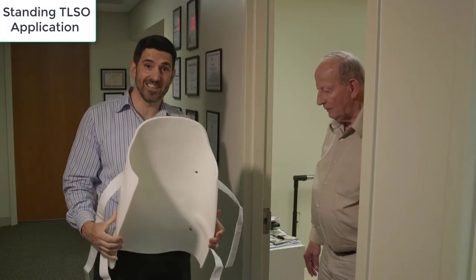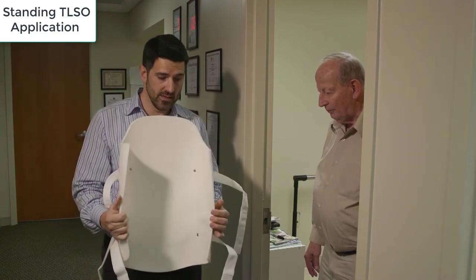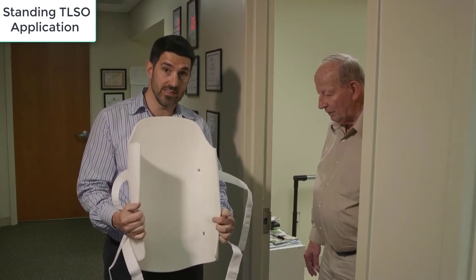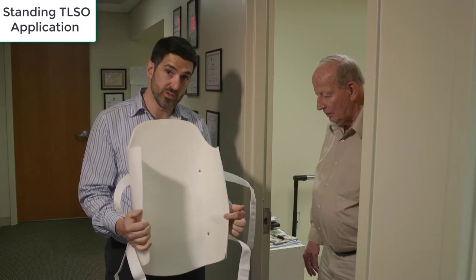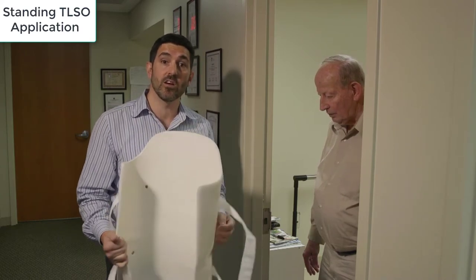Here's the posterior panel of the TLSO. What I'm trying to show everyone watching is that in almost every TLSO I've ever seen, there is a padded waist groove. Some are bigger, some are smaller, but there's always a groove there — and it's there on purpose.